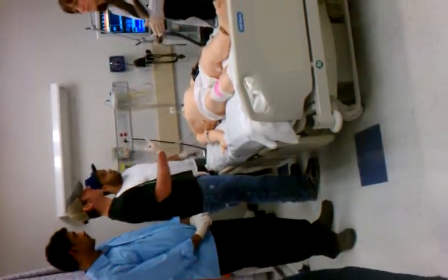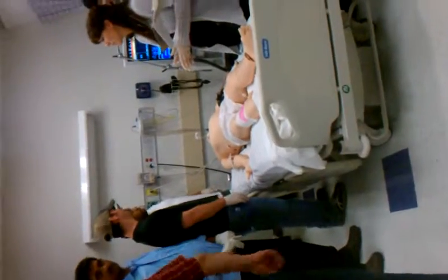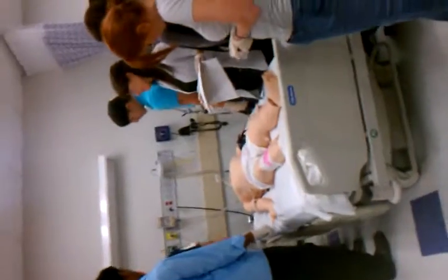I didn't bring in a cool aerosol, so we'll fake it. So let's extubate him. Make sure you take the air out of the cuff first, because he's had this in. We're going to extubate him and put him on a cool aerosol at 35%.